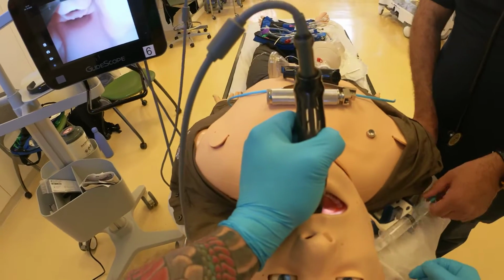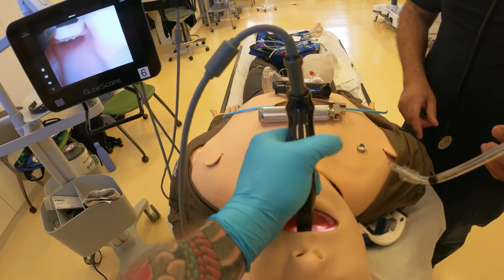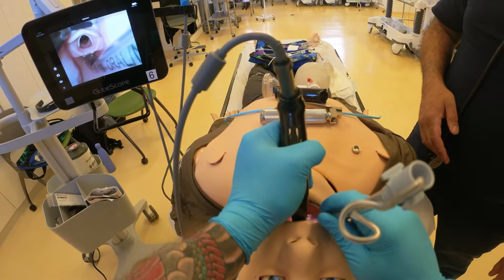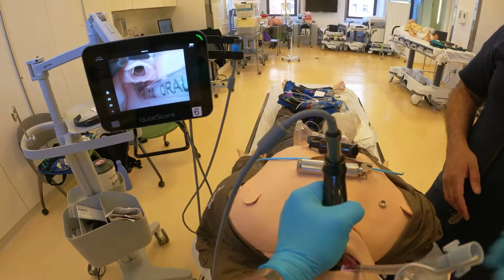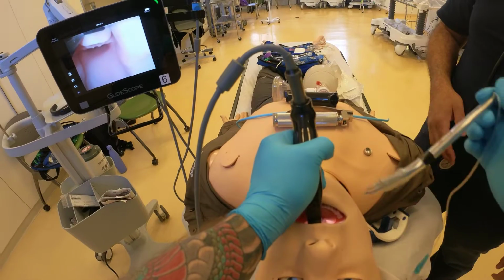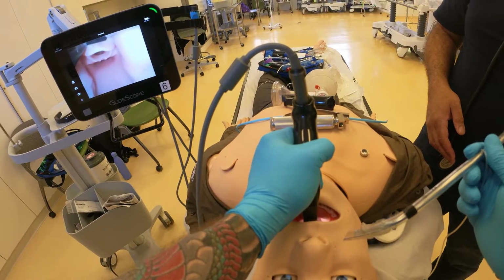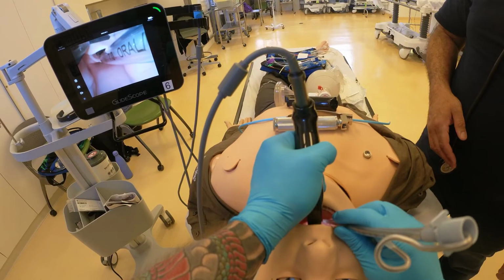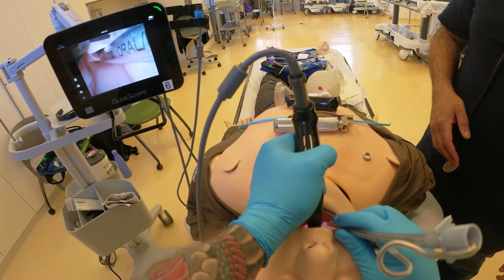Let me show you what it looks like with the tube. So first, I'm going to do a 100% view. And you see naturally it wants to go in the esophagus. You see how the tube is passing through it into the esophageal space. Now, I back out, and then what I do is a 50% view, coming from the side. And automatically, the tube goes right into the tracheal inlet.